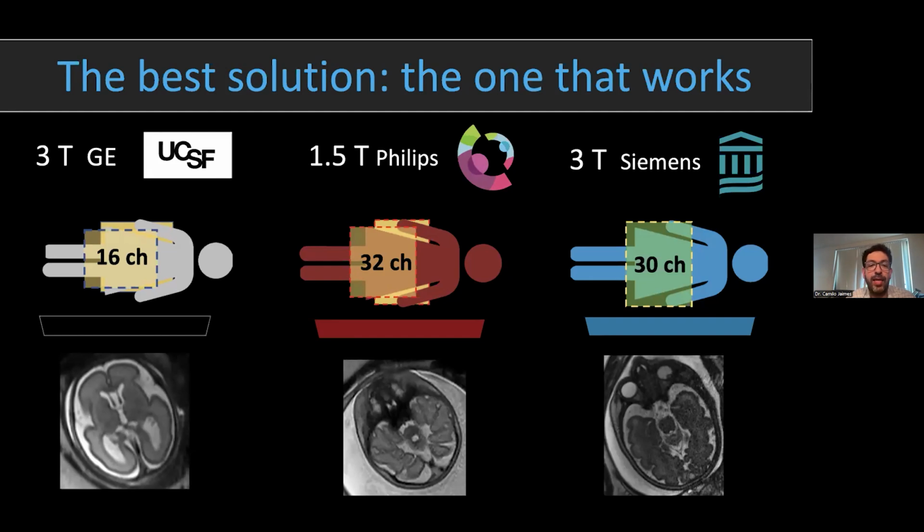I may also say that the deep learning options that are available in GE to denoise some of the HASTE and true FISP or balanced steady-state free precession images are actually really nice and making a difference for image quality. This image in the middle comes from Cincinnati Children's. They use generally 1.5T and Philips, and I think they do a terrific job. I think those 1.5T images hold up well, if nothing else, against some of the other 3T images we see from other centers.